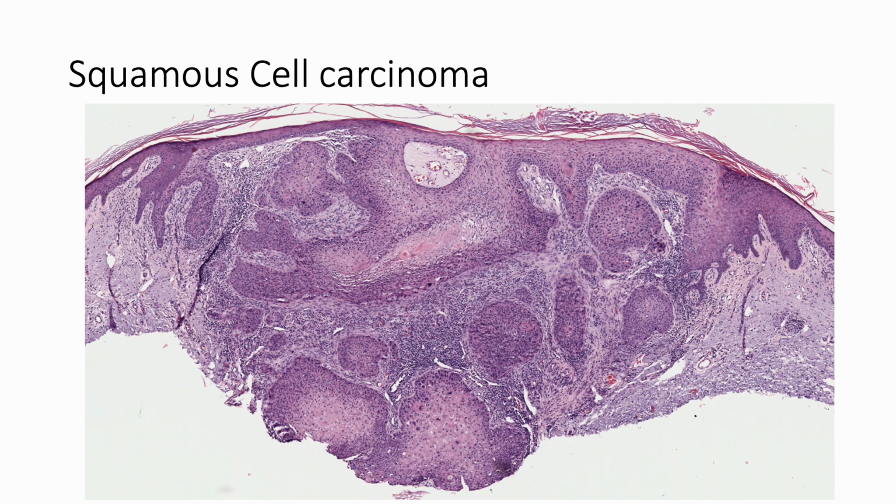If you see a perineural invasion, remember to report that, because if the involved nerve is more than 0.1 millimeter in diameter, that means it has a higher risk and they need to give a more aggressive treatment. Just pay attention to that.